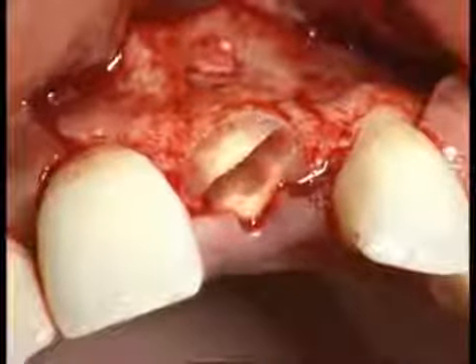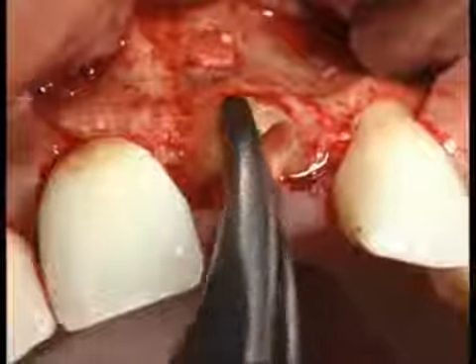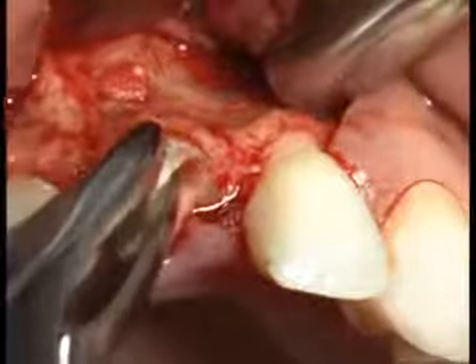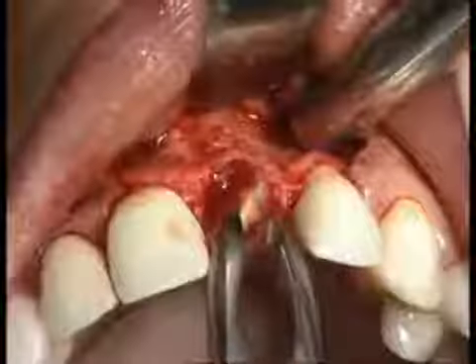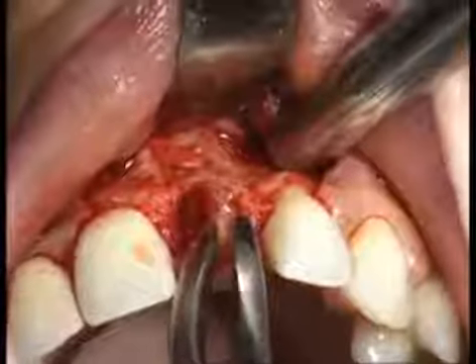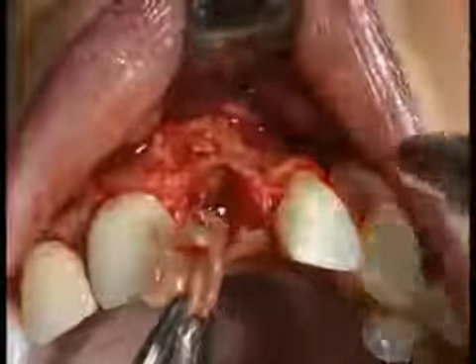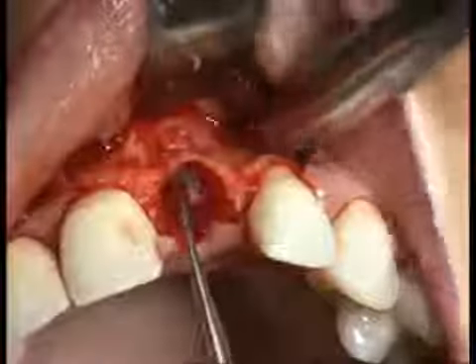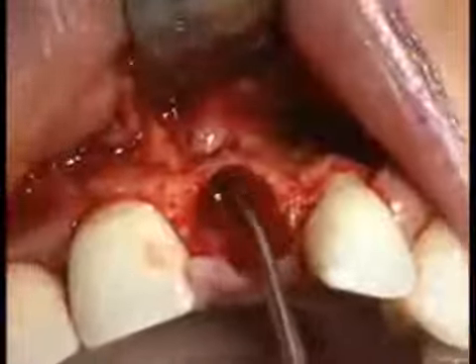The smaller fragment is luxated first by small and careful rotational movements and then removed with pliers. After that, the second root fragment can be extracted from the socket. The granular tissue in the apical region must be carefully removed with curettes.